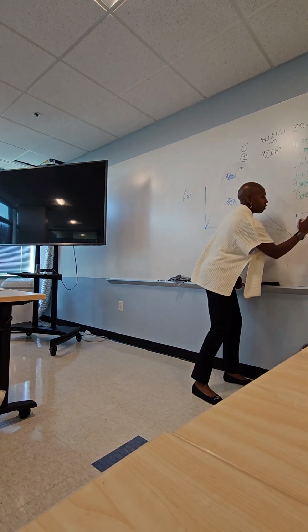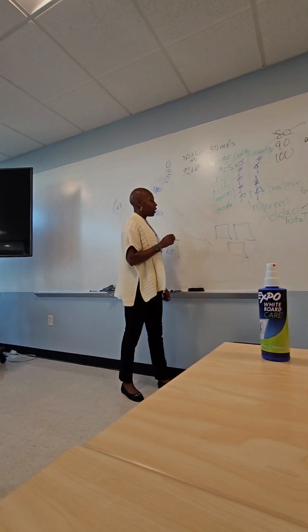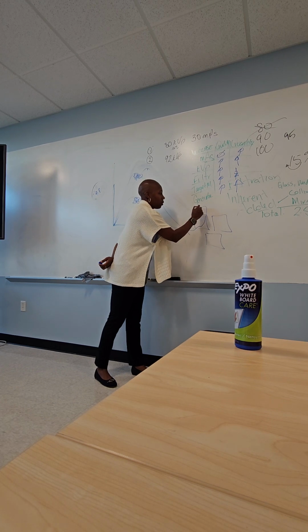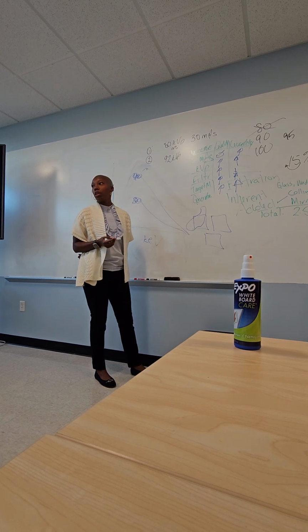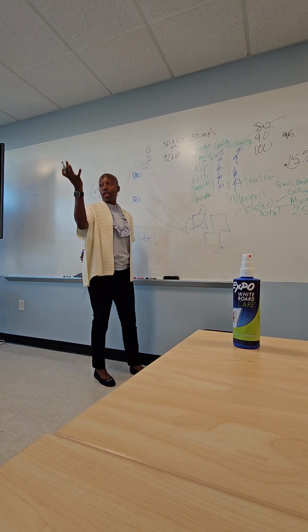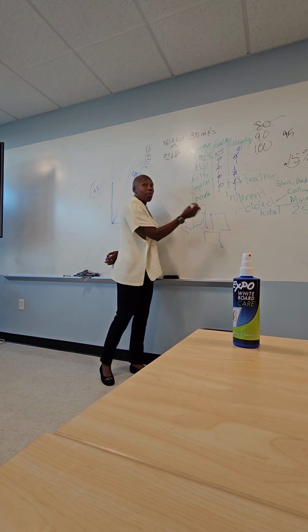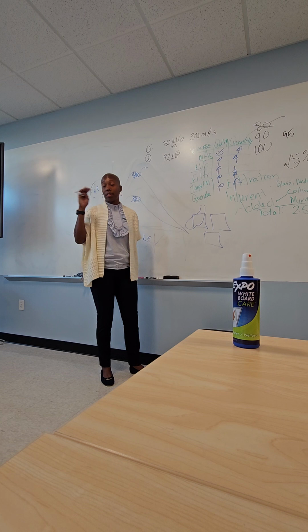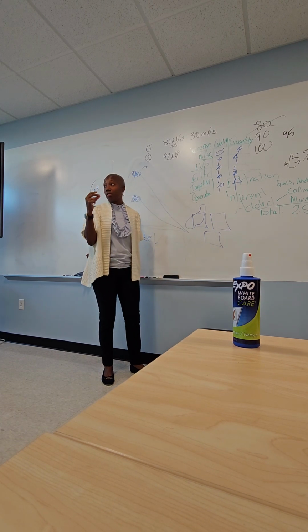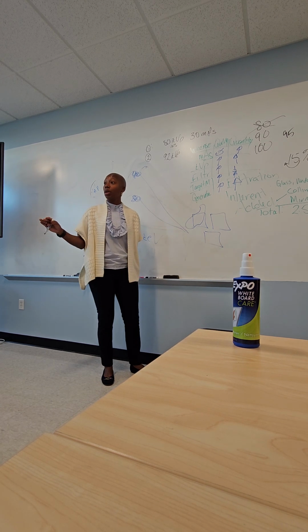If you think about it like this, you've got 3 cells. Let's just say, I like the one the book gives, I was doing a barium study of someone's stomach. Well, your stomach is over one of the chambers, it isn't over all of them. So what is that unit going to do? AEC will average the amount of radiation you selected. You selected your kVp, and it's going to determine how much it needs to terminate. It does it by itself. You don't get to choose it. That's the point of AEC. It automatically will do it.